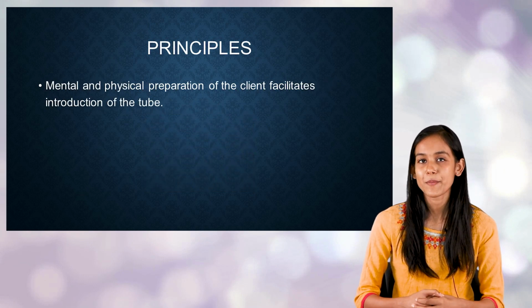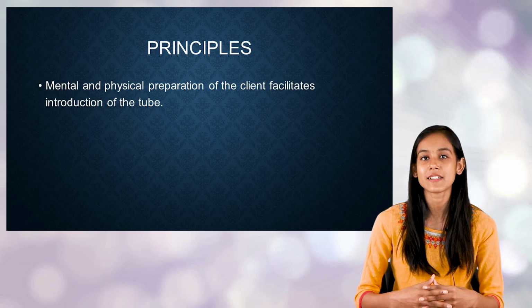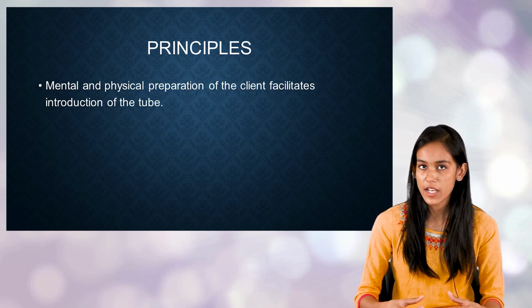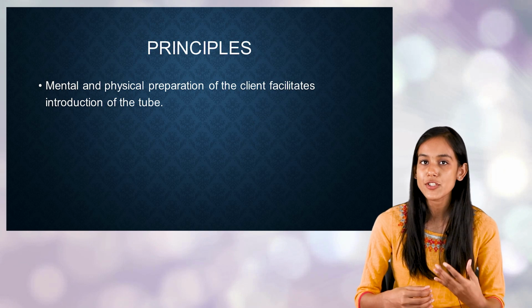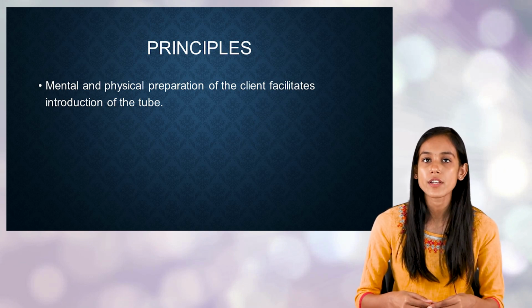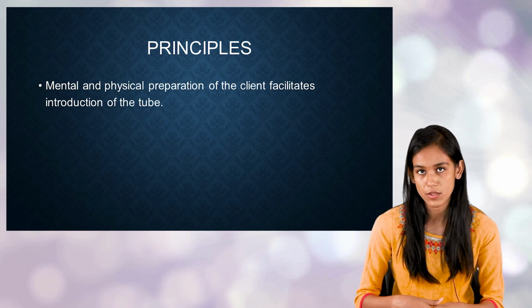The next principle is that you have to prepare the client mentally and physically. Here you need to understand that introduction of the tube into the nostrils and the stomach is a frightening situation, right?